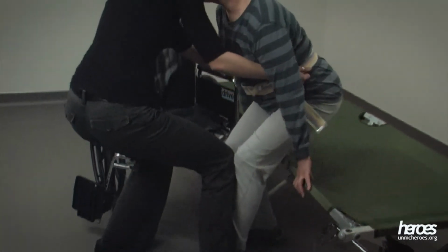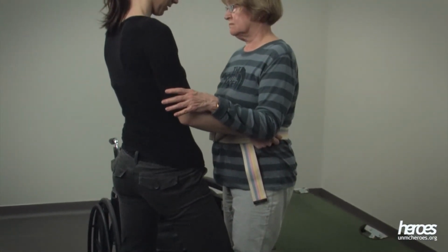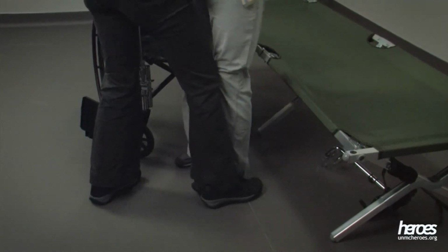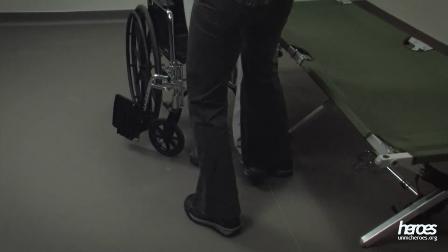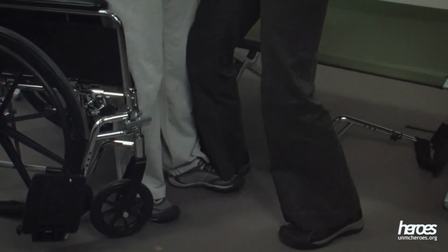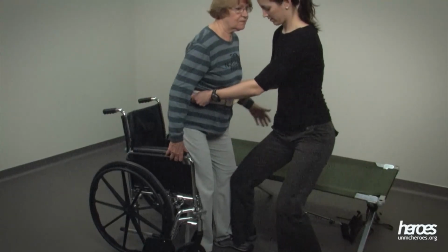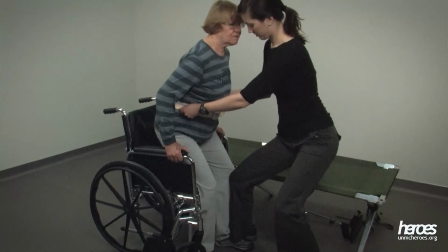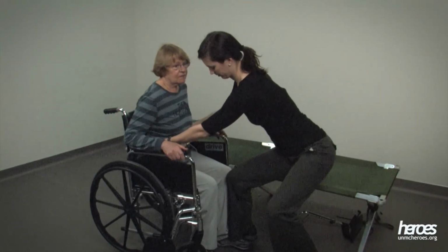Once the individual is standing, have them place their hands around your arms just above the elbows for support. The individual then pivots or shuffles their feet toward the wheelchair. As the individual pivots their feet toward the wheelchair, you may need to keep the weaker leg supported by having your leg against their upper shin to keep the leg from buckling. When the individual feels the back of both their legs touching the wheelchair, have them reach back with one or both hands for the armrest of the wheelchair as they slowly lower to the sitting position.